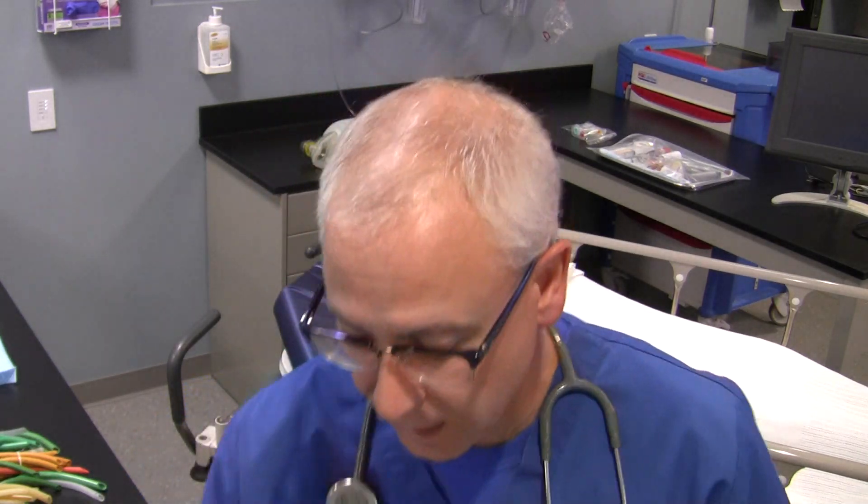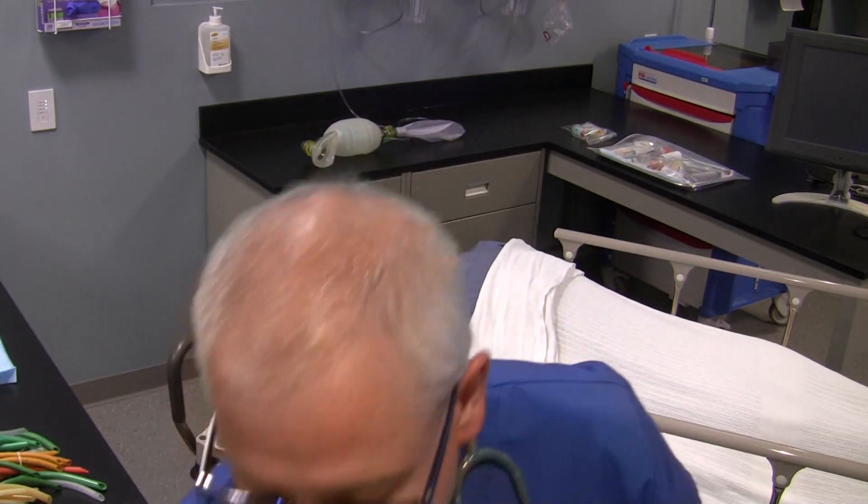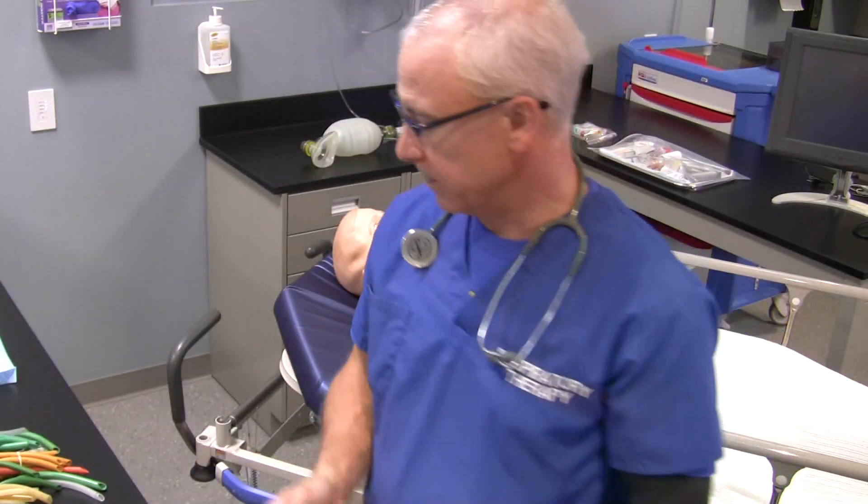So how do you prepare a nasopharyngeal airway? First of all, it needs to be sized for the patient — individually size the NPA to the patient — and it needs to be lubricated. So part of that preparation is sizing and lubrication. I'm going to show you how to size the nasopharyngeal airway.